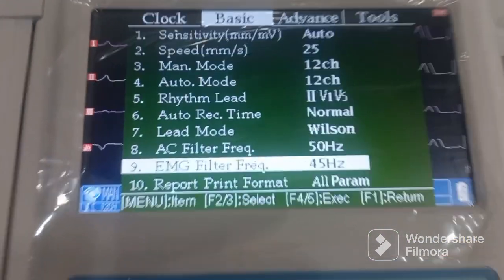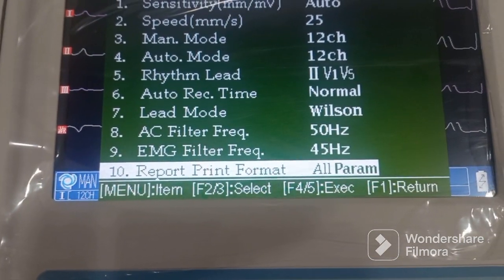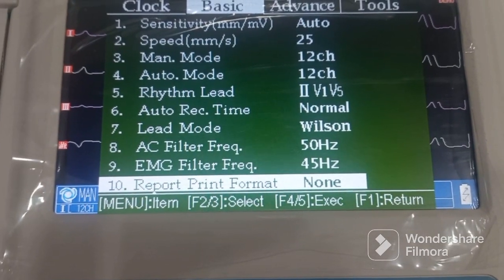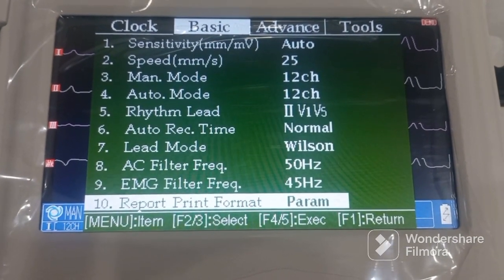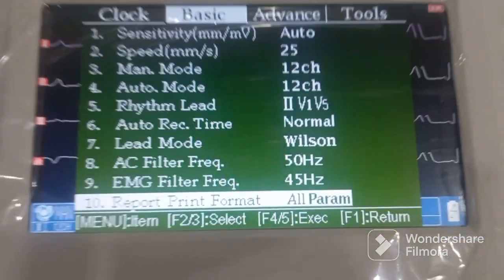There is also the report print format setting. If you need all the parameters you can keep it on 'all parameters', if you want only the waveform put it on 'none', or if you want only the parameters without the analysis set 'parameter only'. We would prefer to keep it on 'all parameters'.